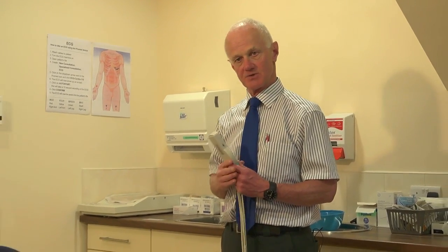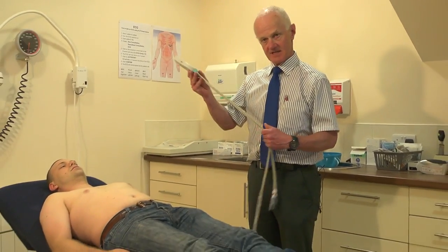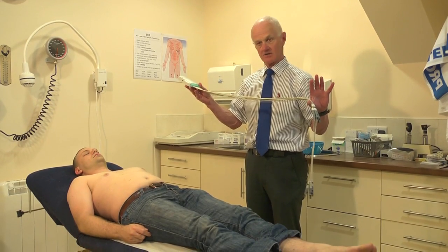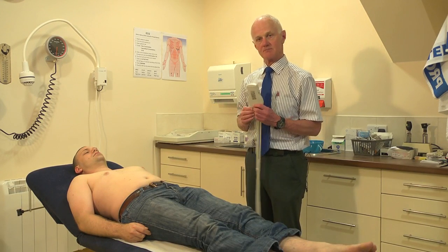In this video we're going to show how to take an ECG from a patient, but this time the nurse isn't available or I'm seeing the patient out of hours. Martin has kindly agreed to be the subject for this ECG. The device for taking the ECG in this case is simple — it's the custom-made Bluetooth ECG, and this is the entire ECG device in my hand.